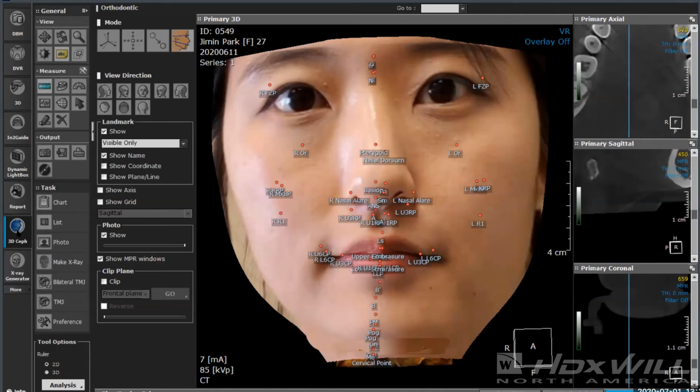Okay, now if you have another scanner, like we have a couple of them, like Carestream, Dentsply, just different scanners in our practices, can you get this software, or is it just proprietary for your products?